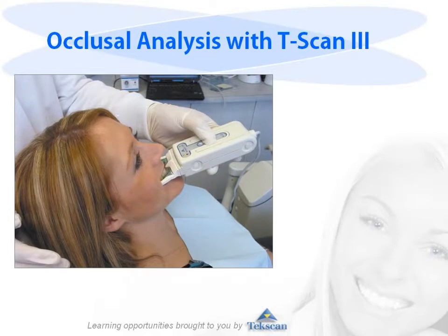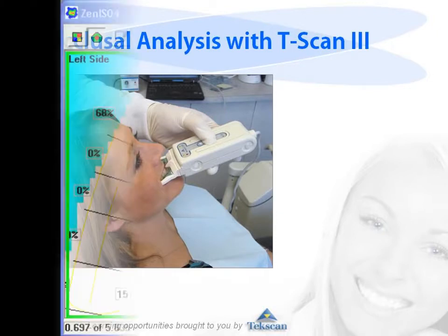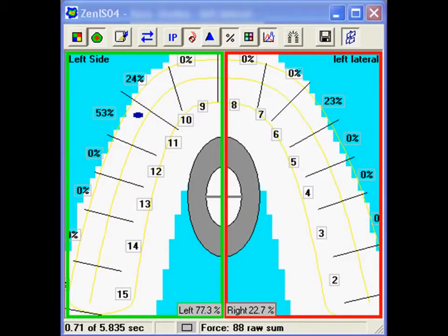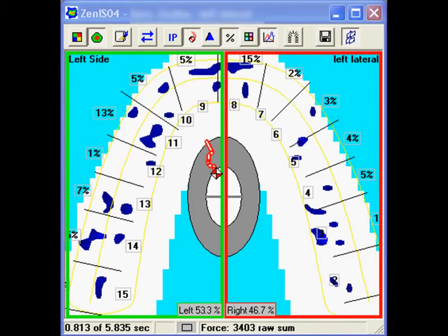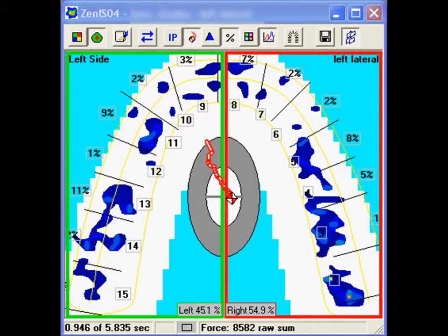The T-Scan3 is a simple-to-use device that records and analyzes occlusal forces and timing using ultra-thin sensors. The T-Scan instantly displays interferences, timing relationships, and force levels for evaluation and treatment of occlusion.